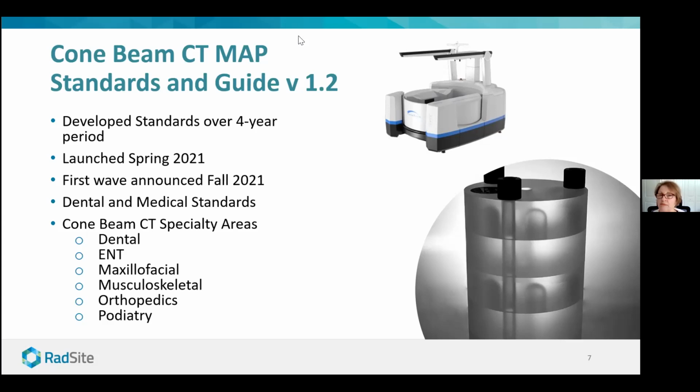So having the machine accredited is not just on CMS. There are more and more insurances going under that umbrella because they understand that maintaining the CBCT scan is important, the reading of the CBCT scan is very important, and that if there is something else, our job is not to fix it, our job is to refer.